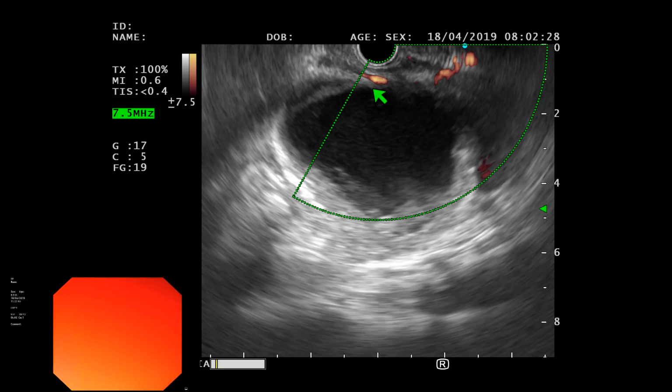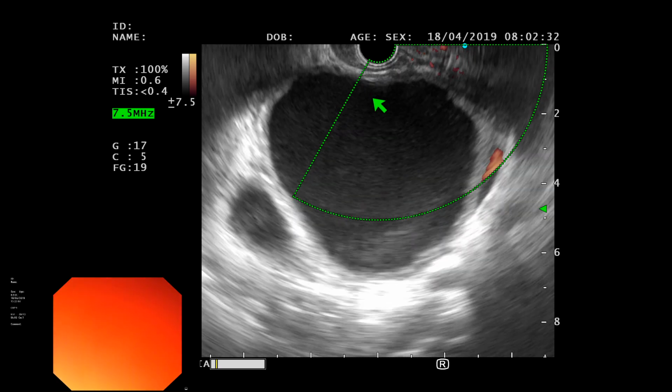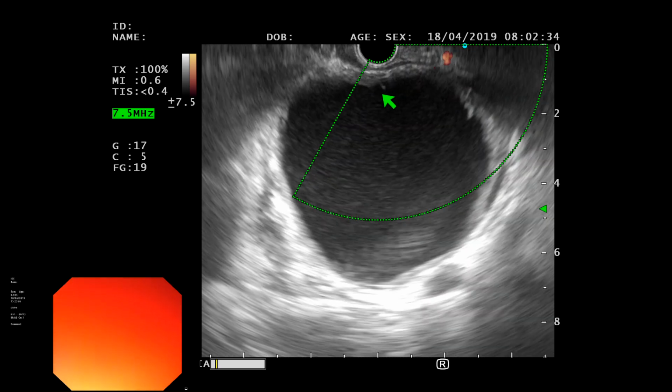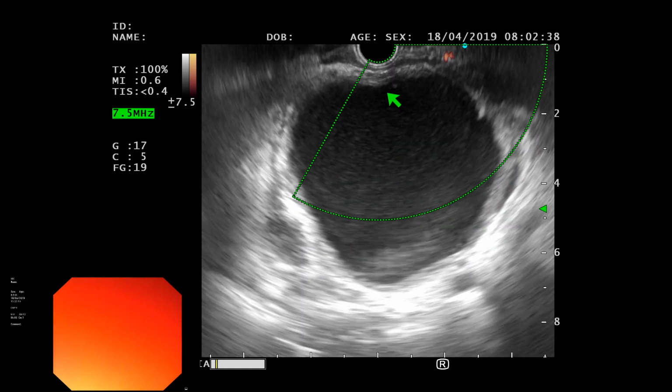So this is not a good case. If you want to wind it up quick, then we may be able to show it better in the next case. Yeah, that's what I'm thinking about. So let's finish it up when you are in D2.